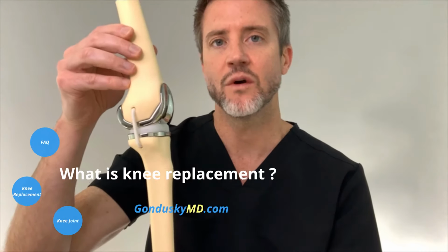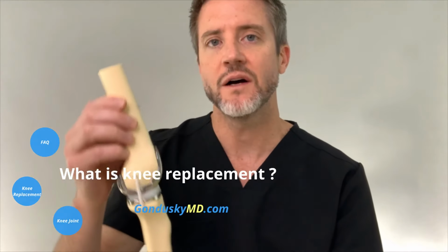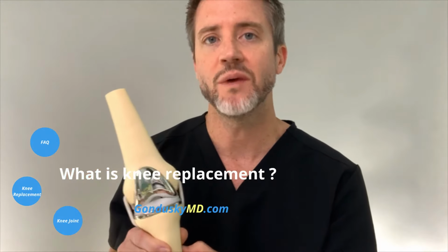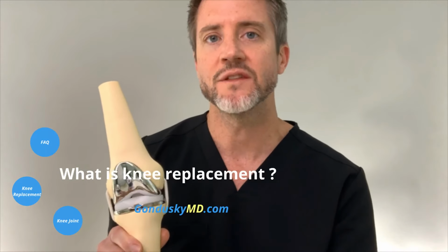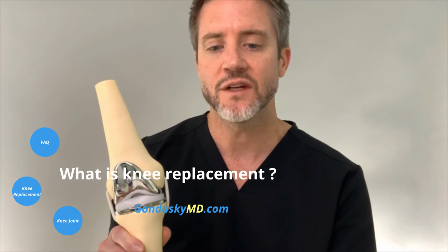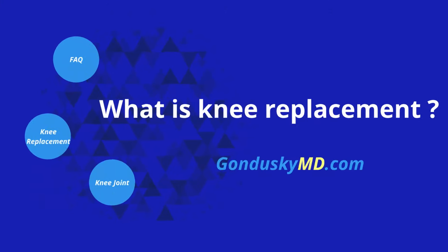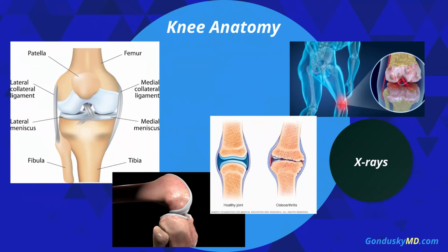So I'm going to teach you a little bit more about knee replacement, and in other talks I talk about what sources of knee pain can be, what the treatment options outside of replacement for knee pain are, and then what the surgery itself is like. So let's talk a little bit about the knee joint, some knee anatomy, some more images of what knee replacement is.